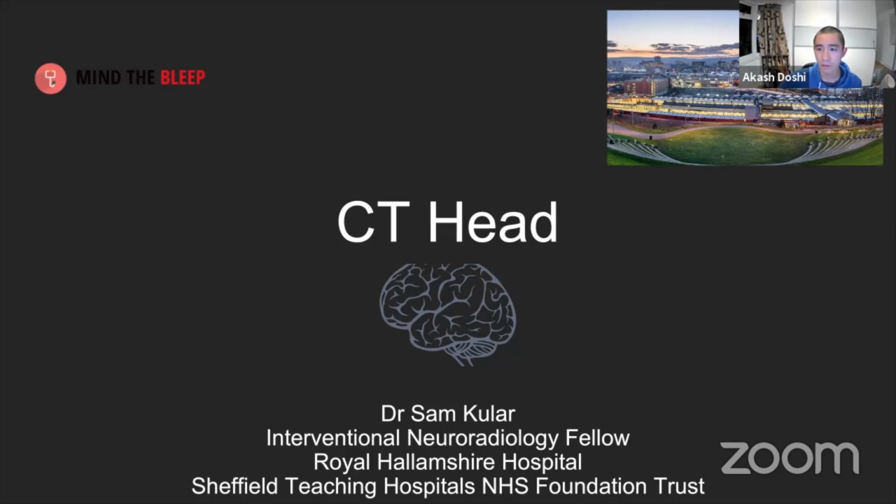So tonight I've got Dr. Kular, who's one of the radiology registrars in Sheffield, who will be teaching about CT head interpretation. So this will cover a logical approach, and we'll also discuss some cases as well.